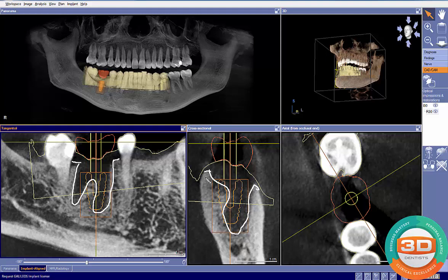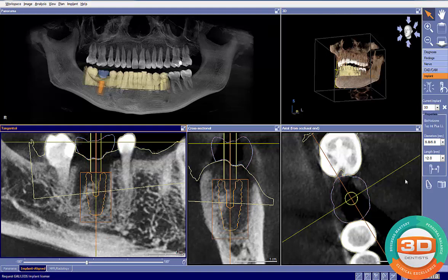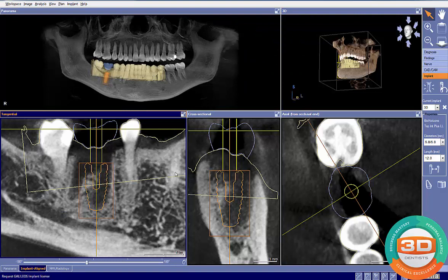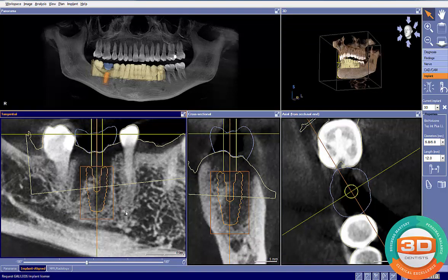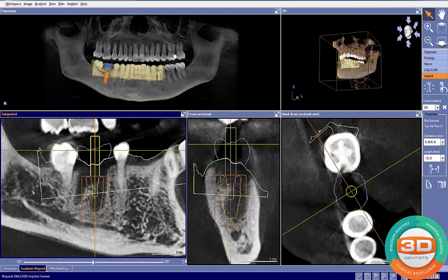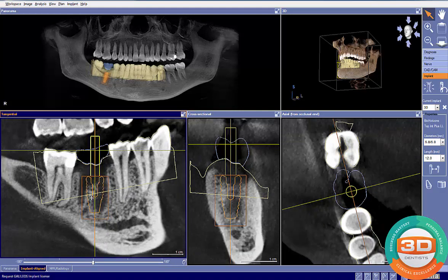We have to look and see how much of our implant is in bone. Let's draw out where our nerve is. Right now we see our two millimeter mark there. One option is to go with a longer implant — a 12 millimeter implant — which still gives us room from the nerve and we start to get more engagement in these areas as well. Another possibility is to tilt our implant to engage into this intercrestal bone.